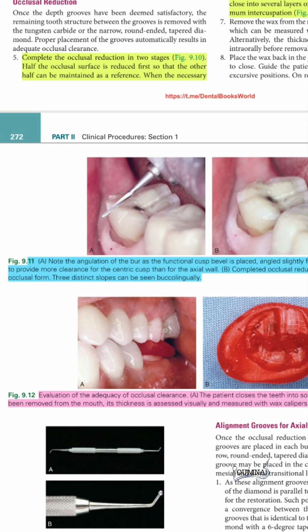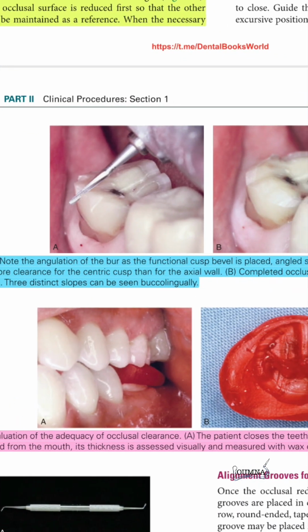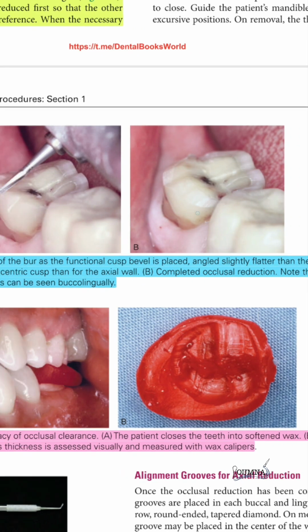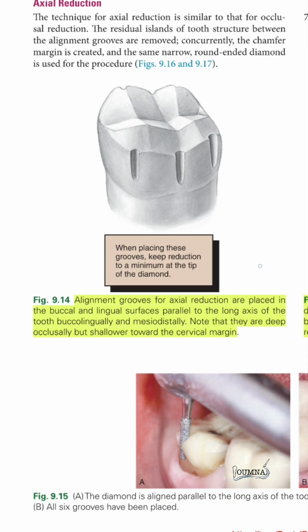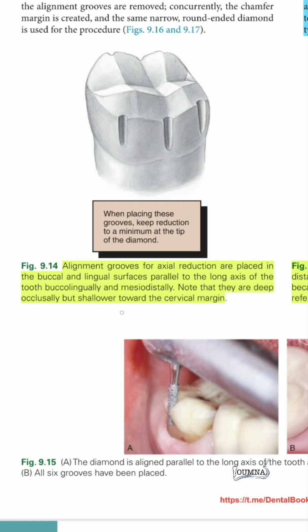to ensure that we get the adequate thickness. Here we follow the angulation of the tooth when we are preparing with the burr. This is the final shape where we have rounded angles and the anatomy of the occlusal surface is maintained. Now when we start the axial reduction, we place the grooves that are aligned to the long axis of the tooth, and they are deep occlusally but shallower toward the cervical margin.